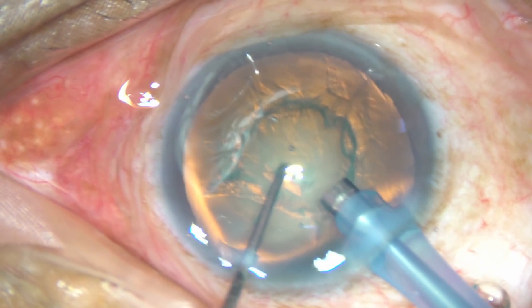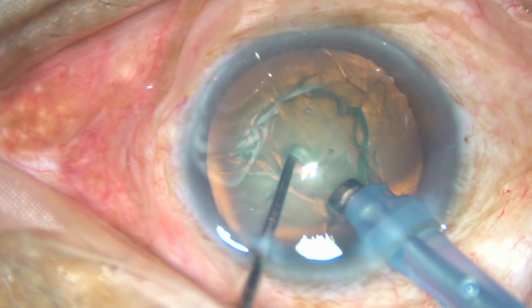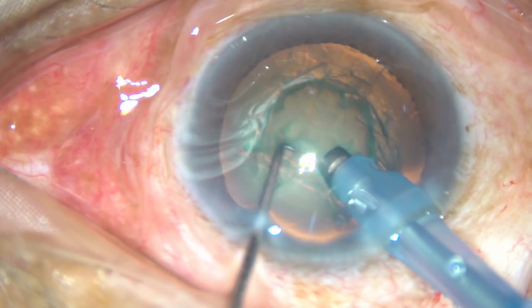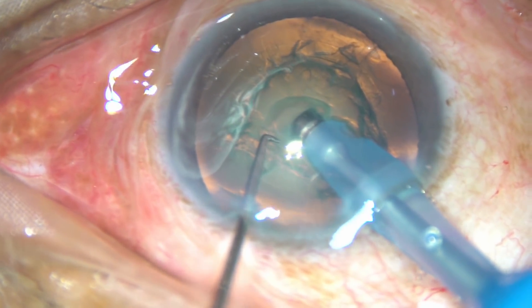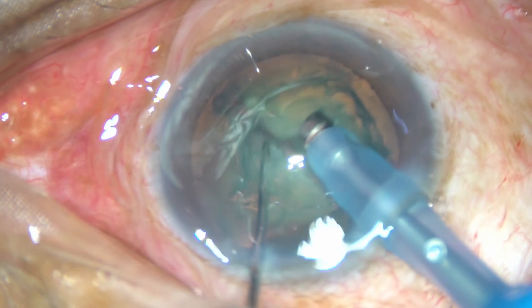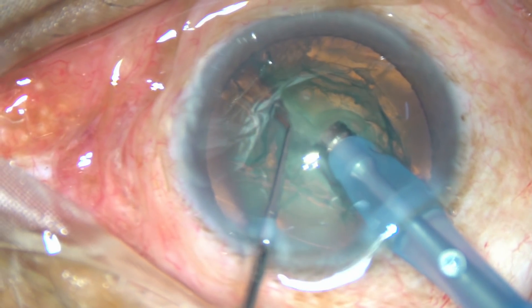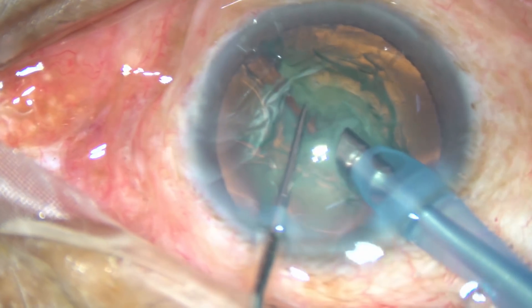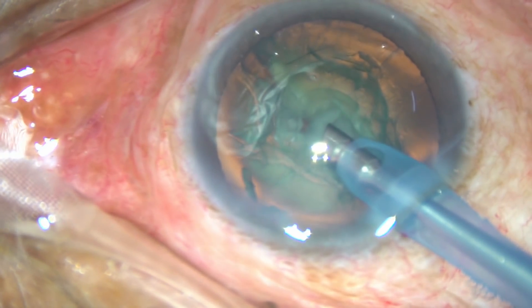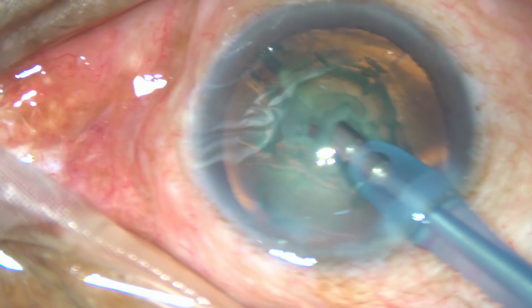Push the lens a little down and enter into the substance of the nucleus. Hold the nucleus very firmly and make your first chop. Be there for a few seconds so that fluid goes from center to periphery. And now, this is what you can say is the 3 o'clock chop.